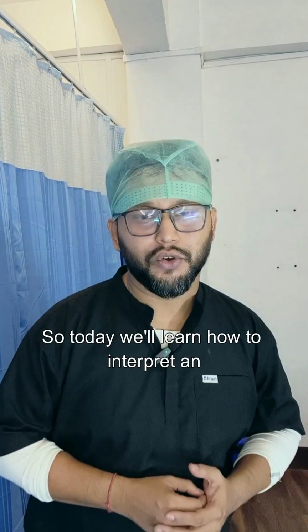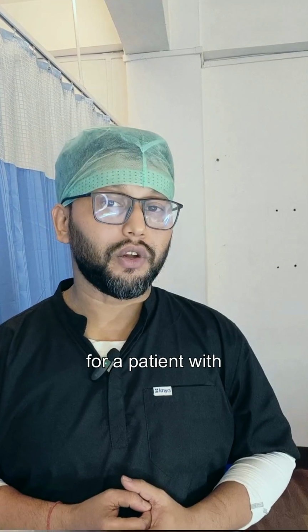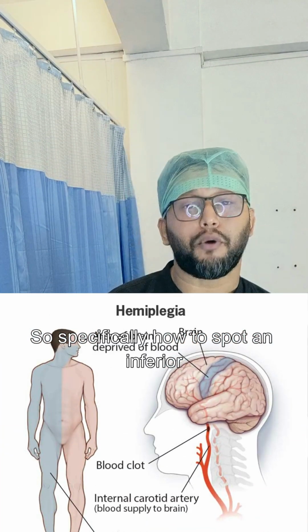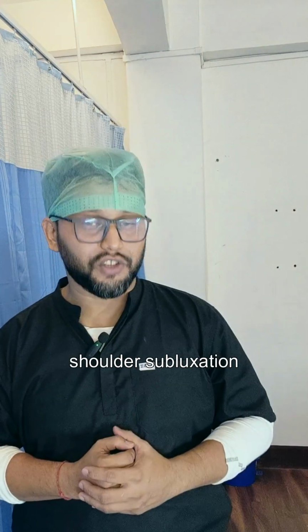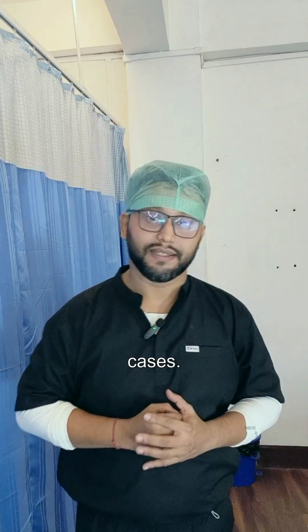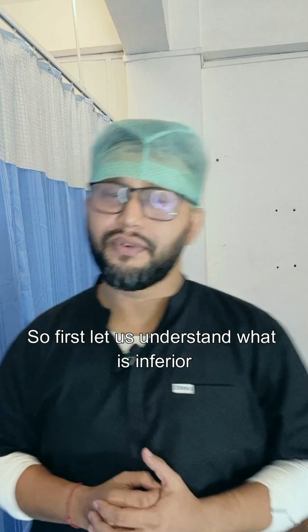Hello students. Today we'll learn how to interpret a shoulder x-ray for a patient with hemiplegia. Specifically, how to spot an inferior shoulder subluxation, which is very common in these kinds of cases. First, let us understand what inferior shoulder subluxation is.